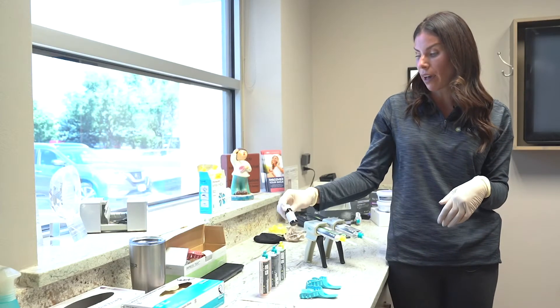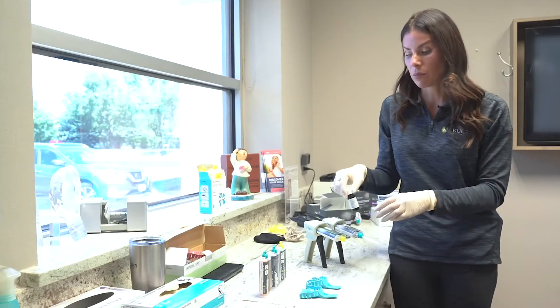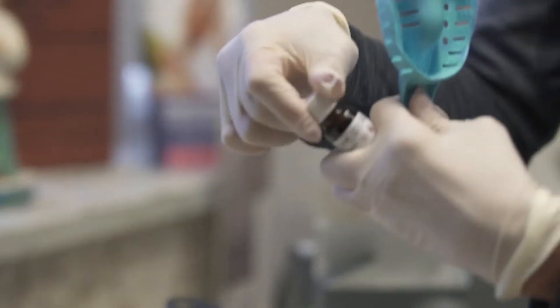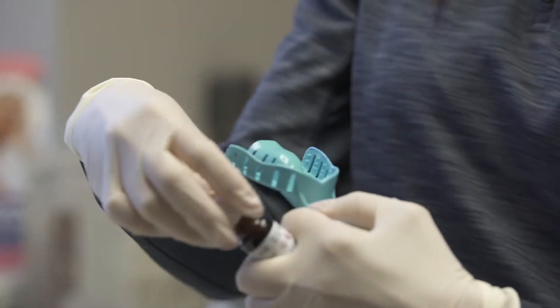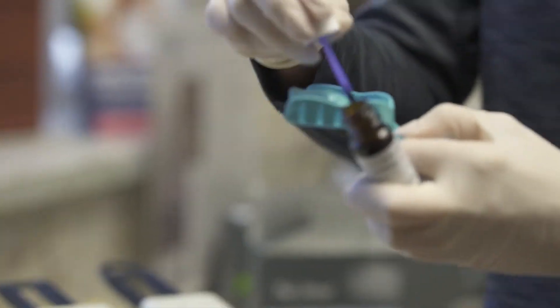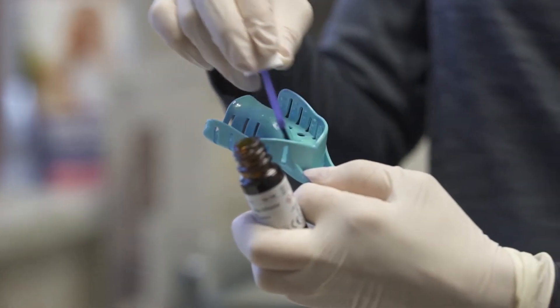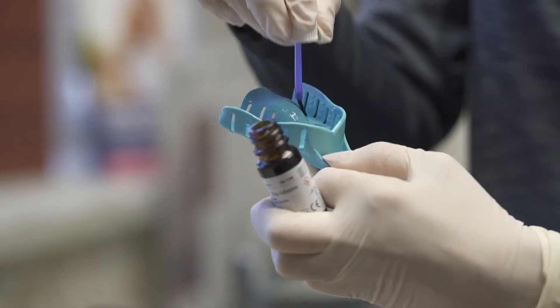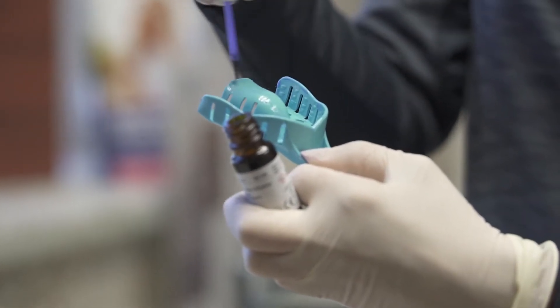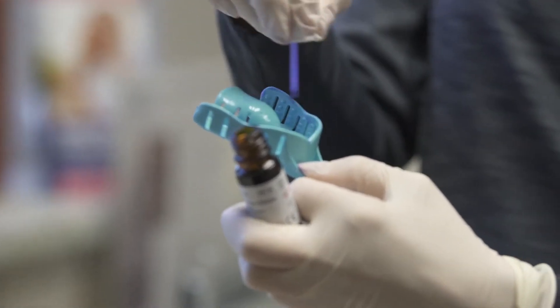Number two in this process: you want to make sure that you have a tray adhesive. This adhesive is applied to the tray for the heavy body to stick to it. Take your tray adhesive and paint on a thin layer of material inside the tray, so that the heavy body doesn't pull off.